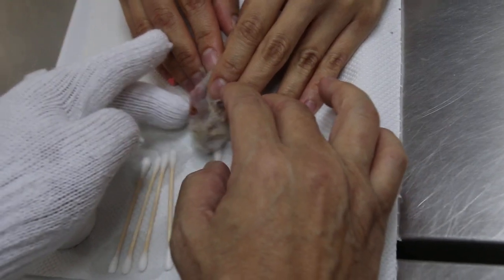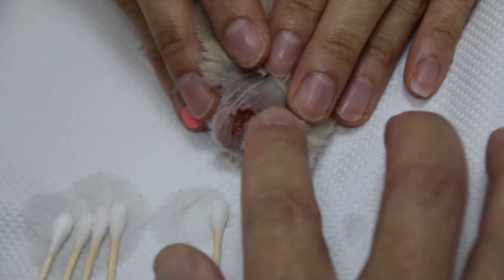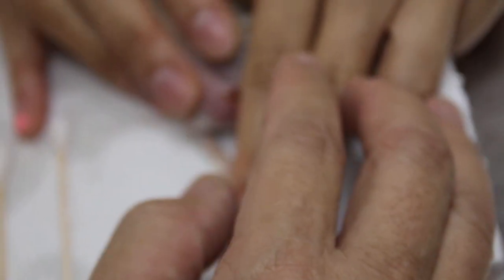This dwarf hamster had an operation to remove an ear tumour. Now to clean the wound, put the hamster on — hold it. The best is for the owner to hold it, because the danger of doing it here is that the hamster might fall off the table.